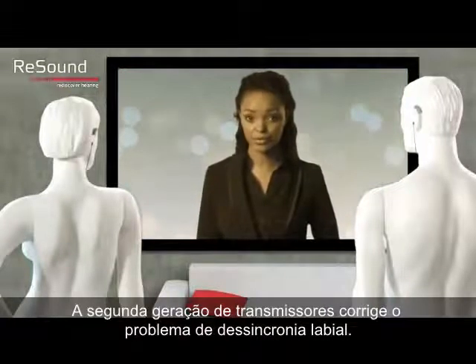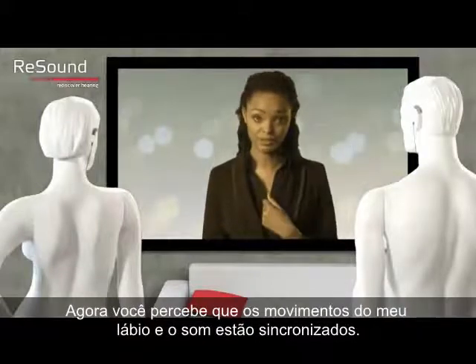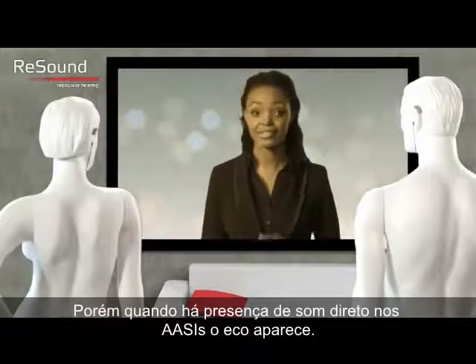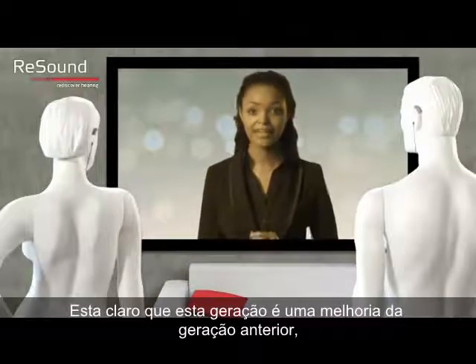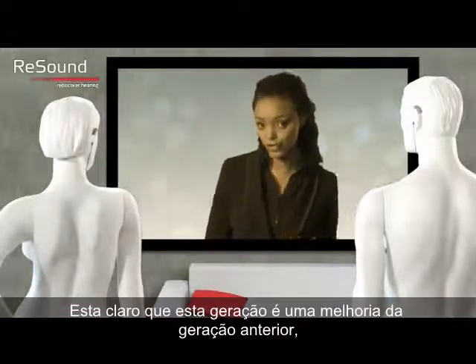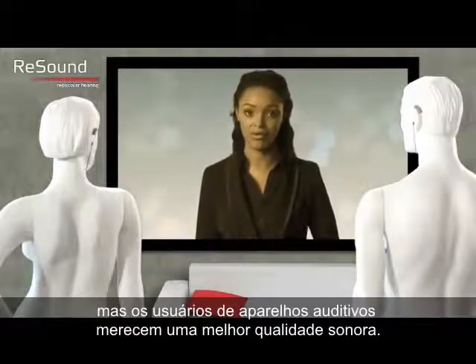The next generation stereo streamers corrected the lip sync issue. Now you will notice that my lip movement and sound are synchronized. But the moment we add the direct sound, you will notice that the echo returns. It is clear that this generation is an improvement over the first generation, but hearing aid users deserve better sound quality.